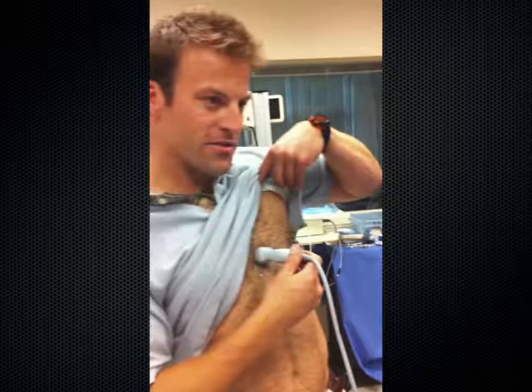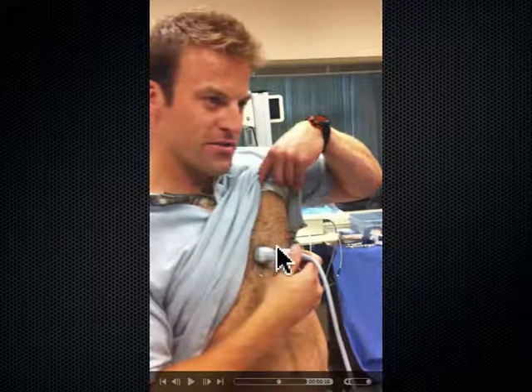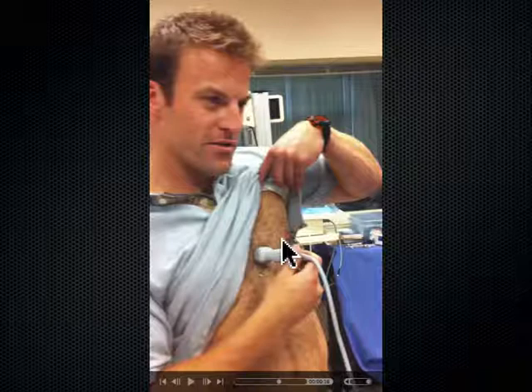So that's Eric Mervis. He's one of our residents in the emergency department, and when I first saw him do this, I thought, wow, does he just have really wide-spaced nipples? Because look how far apart the probe is from his nipple. But he doesn't. I looked for a web neck. It's because he's standing up, and the heart shifted in his chest cavity a little more medially.